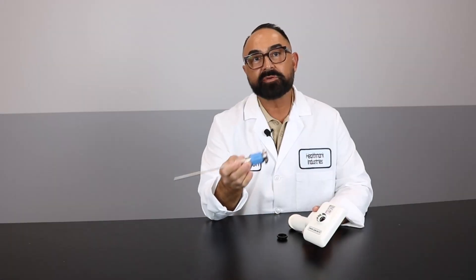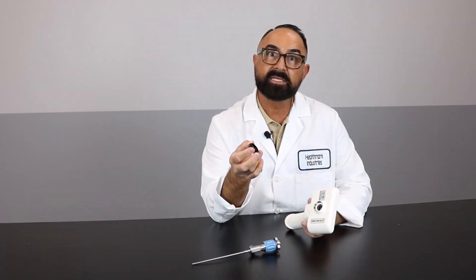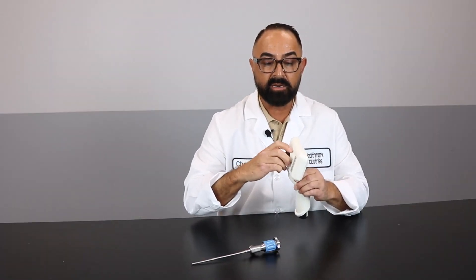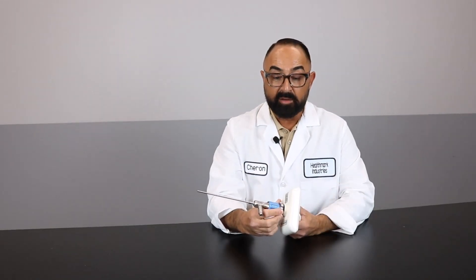If you have Stryker endoscopes and you want to use them with the EndoProCam, sold separately is a Stryker adapter that's a spacer in between the rigid scope and the EndoProCam itself. You can simply screw it on instead of the coupler and then screw your endoscope directly into the EndoProCam. To have a clearer image, you will need the Stryker adapter in place. Without it, you'll have a poor quality image.